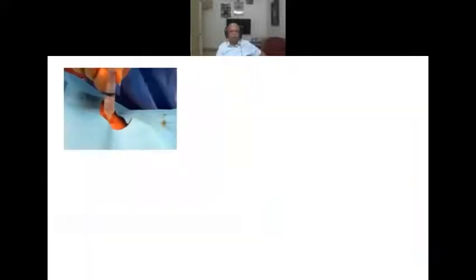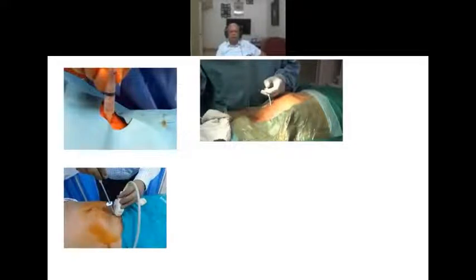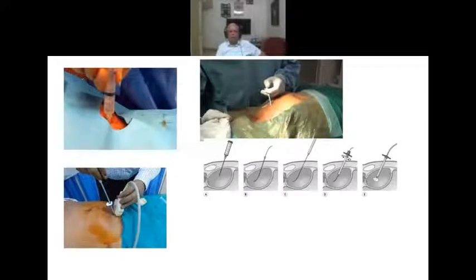So this is how a suprapubic cystostomy is done. First, you can put a needle and aspirate clear urine. Then you can use a trocar. Then for everything we use ultrasound. So you can use an ultrasound to pass the trocar, and use a Seldinger technique like this.